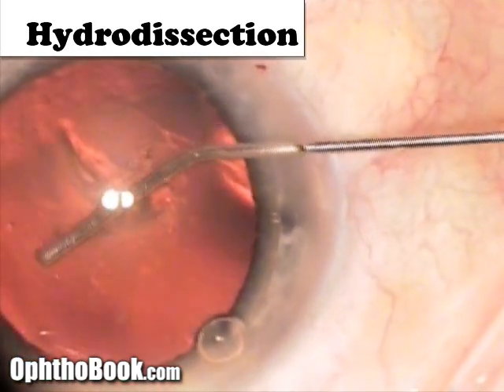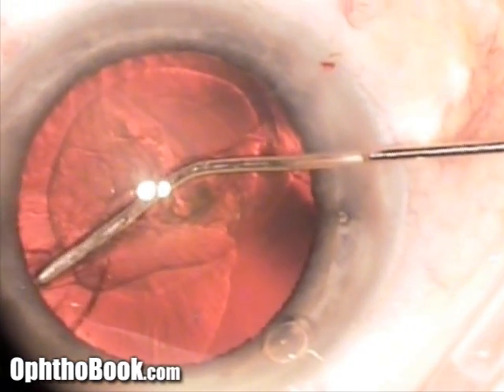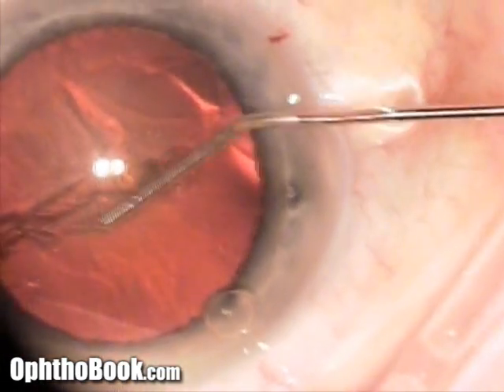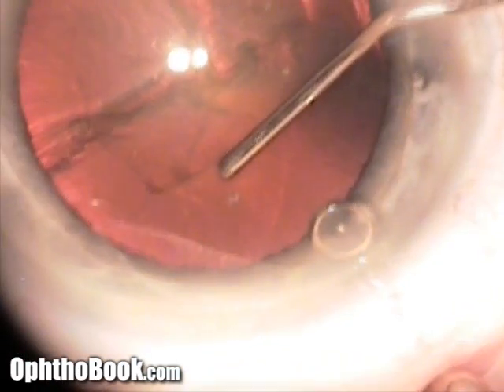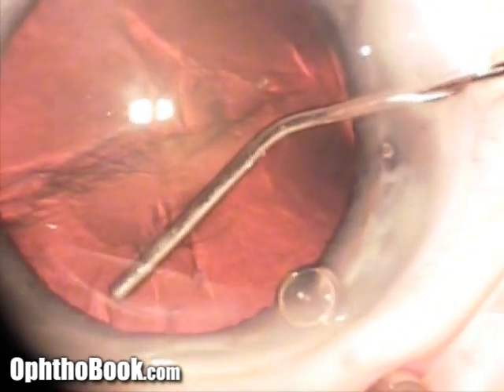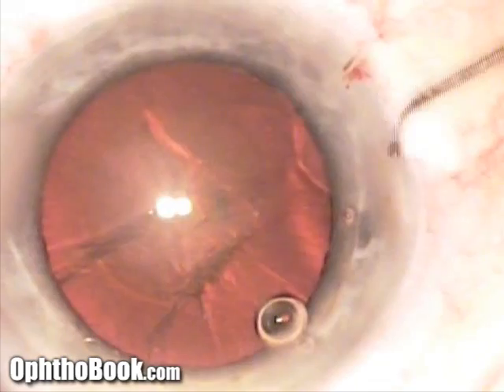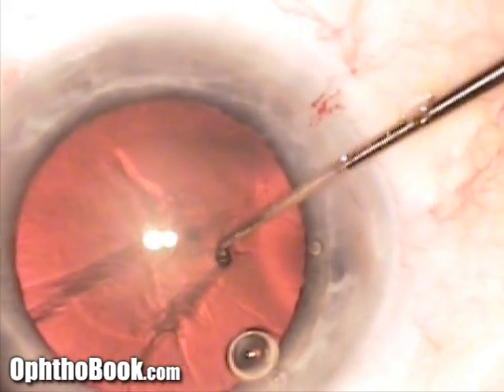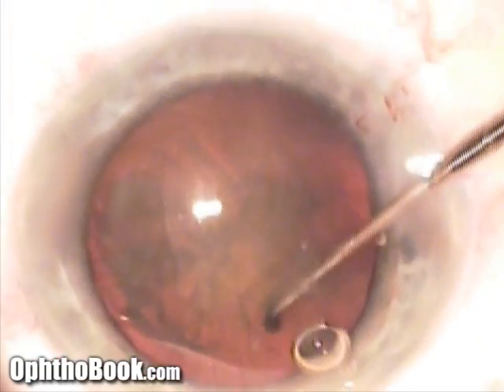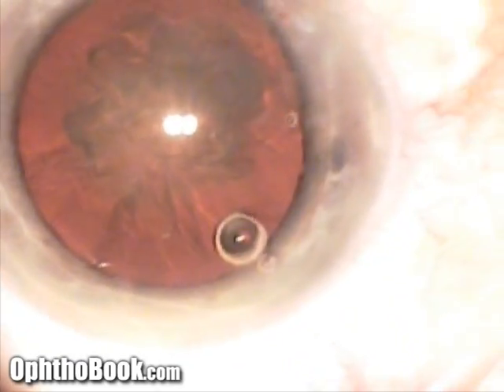Now we've created our capsulorexis. We'll do hydrodissection — injecting BSS solution between the chocolate layer and the hard candy shell to separate them. You can see a little fluid wave going behind the cataract; that's water rushing around the back of the lens. We tap down on the lens to push the water around, then spin the nucleus to confirm it's free inside the bag and ready to be removed.